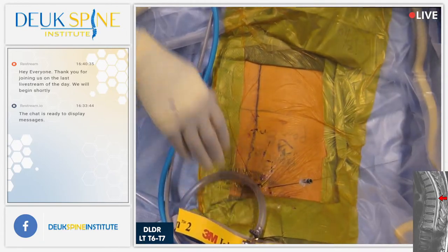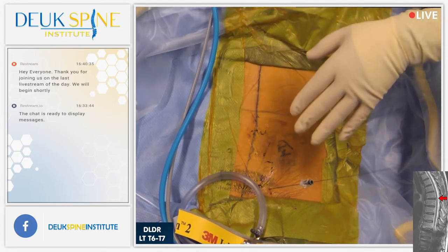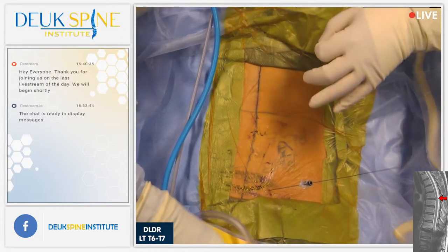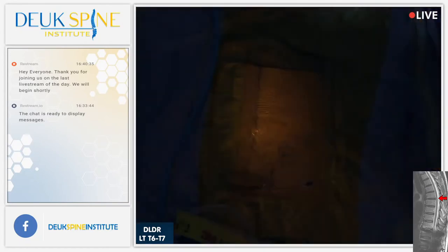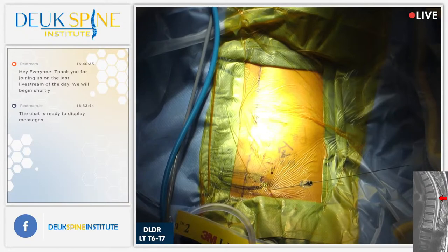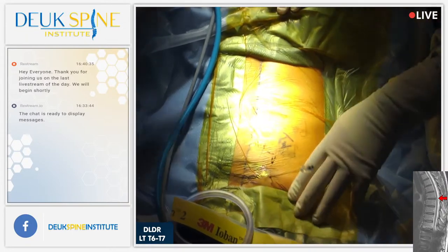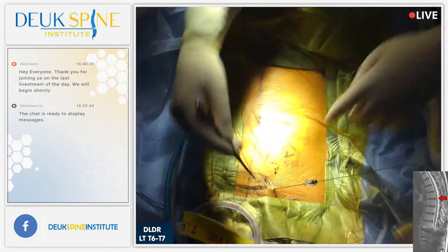All right. So at this point, we've confirmed that she has pain at that disc, T6-7, that there's a tear in the back of the disc, that's where the pain's coming from, and that's her typical pain. We call it concordant. It's just a funny medical term. Lay still, don't get up. You had her nicely asleep.